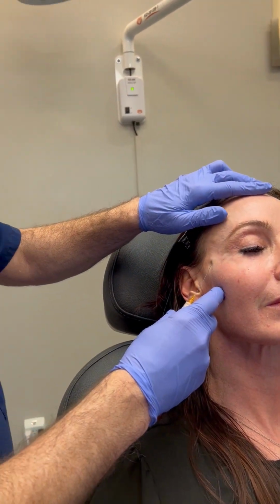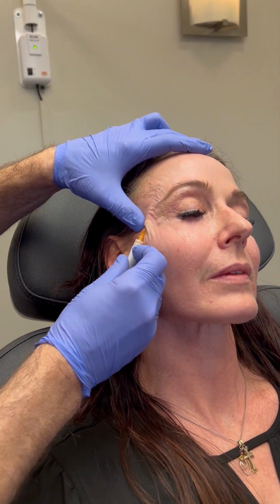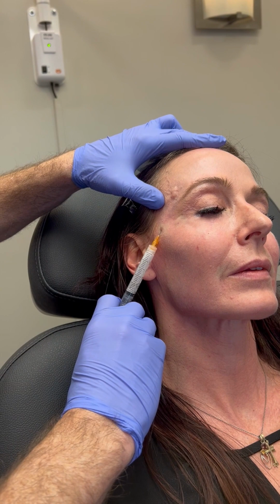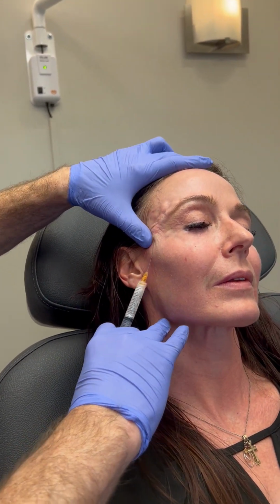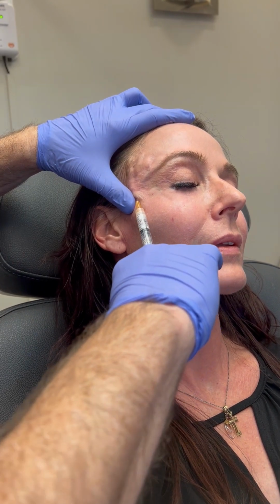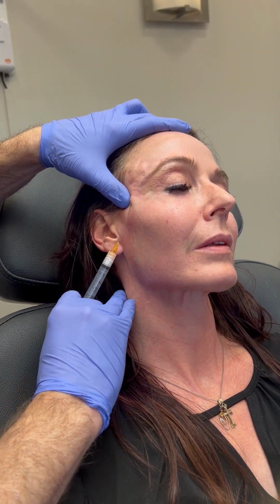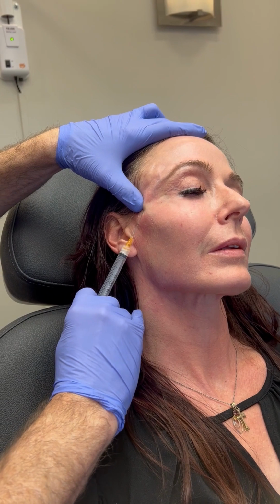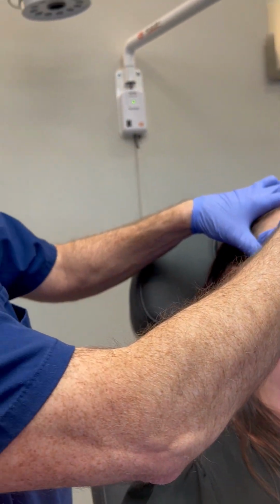There's a cannula in the temple. Some people like to place the Sculptra deep. I like to place it superficially with the cannula, and we're using 3 cc's here. Our Sculptra is the typical 9 cc dilution. We're just going to put it under the skin here, above the muscle, where we can get some good collagen production, and we're just going to fan it around with our 1.5 inch 25 gauge cannula, and then I'll do a little massage here.